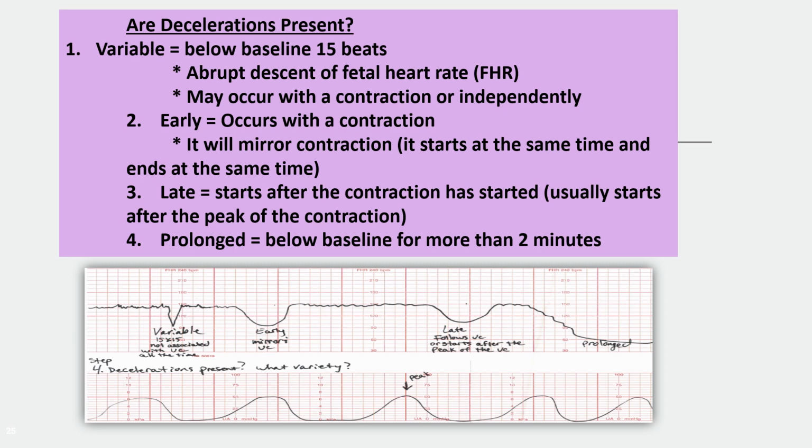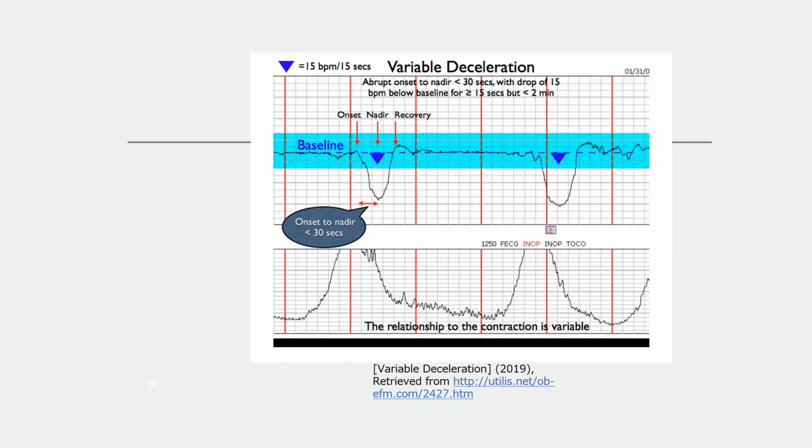the placenta. Then here you have a prolonged deceleration. Okay, this is usually an acute event, where it stays down. And usually it's caused by a seizure or it could be a prolapsed cord. But if it's going on longer than 2 minutes, that's going to be a cesarean delivery. We're crashing the patient.